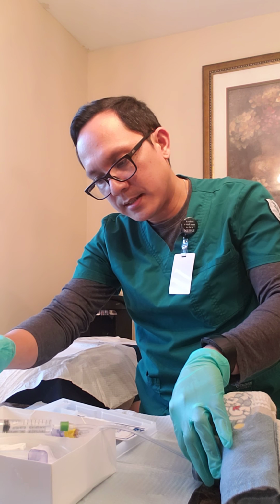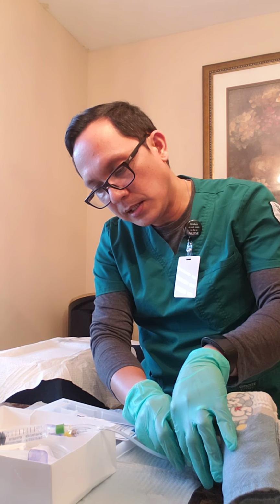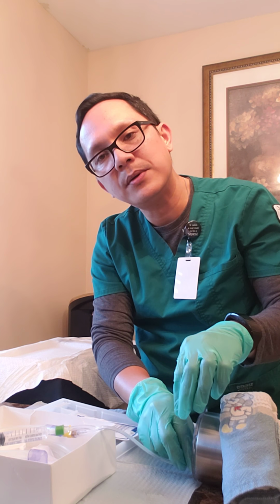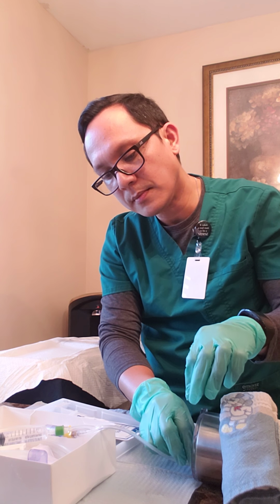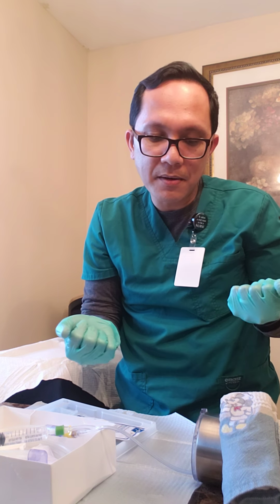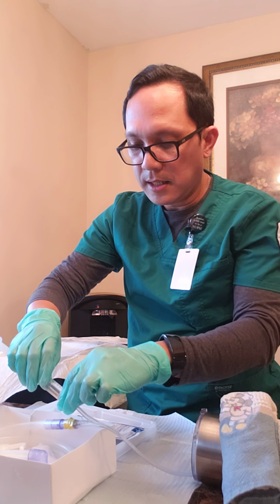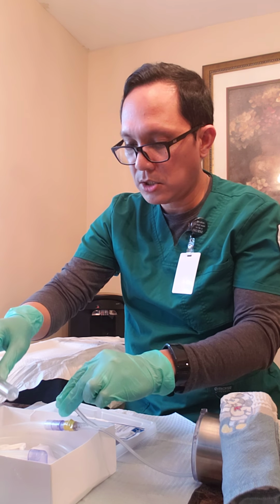All right, once that's done, I'm going to pull gently on the Foley just to make sure that the balloon is in place. Once that's done, I'm going to tell my patient that she can now relax. All right, Mrs. Smith, you can now relax. All right, I'm just going to take the syringe out.